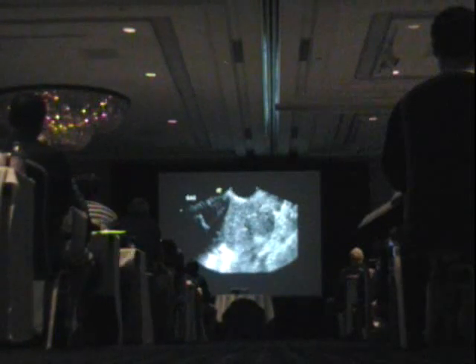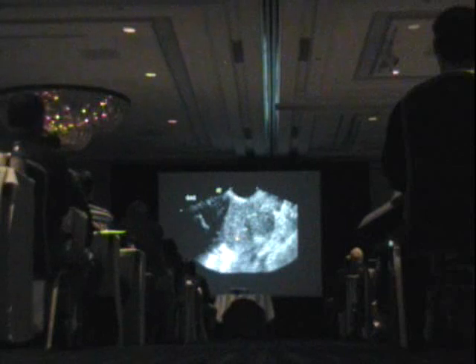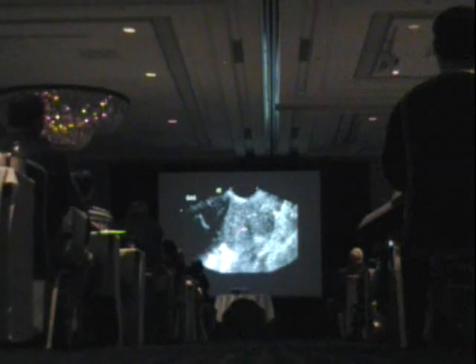Here's a patient that I was talking about before where you really just can't find the endometrium. We just couldn't tell where it really was in there. Is this a little bit of it here? Not really sure. We think there's a fibroid in there, but is this the endometrium sort of bending over the fibroid maybe? Very hard to see where the endometrium was.